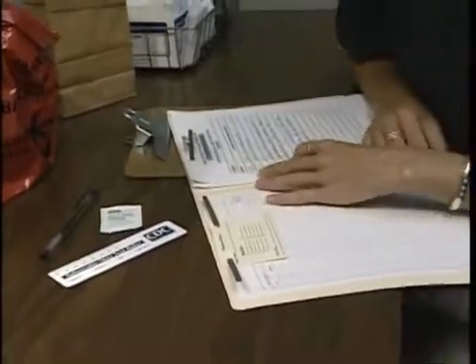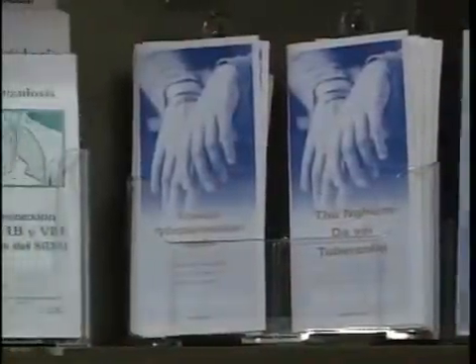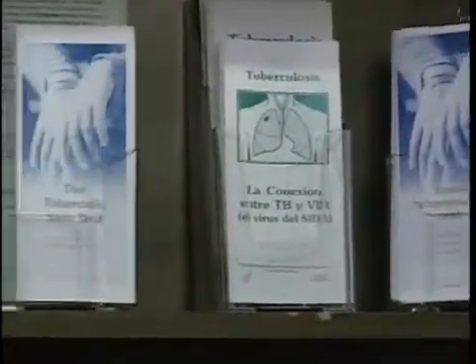You'll need the patient's record or other appropriate forms for documenting the measurement results. Also, have culturally appropriate patient education materials available for the patient to reinforce information that is explained to the patient, help answer questions, and provide information on follow-up evaluation.